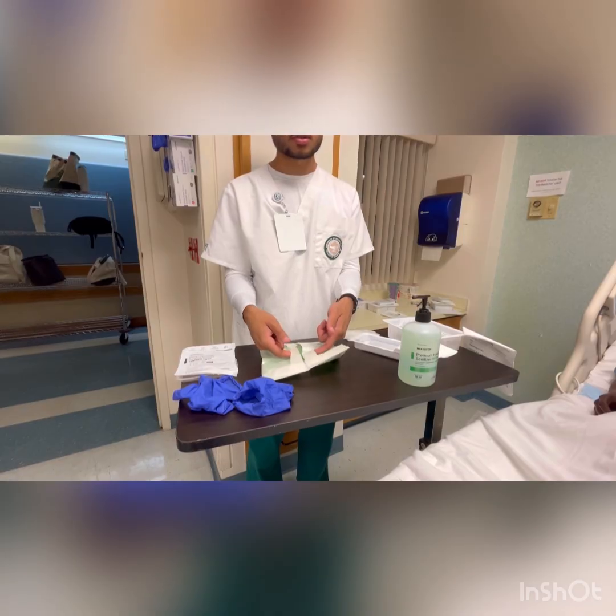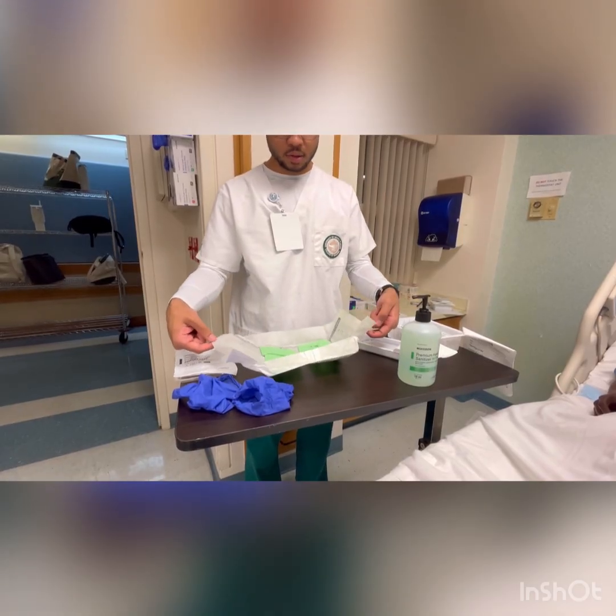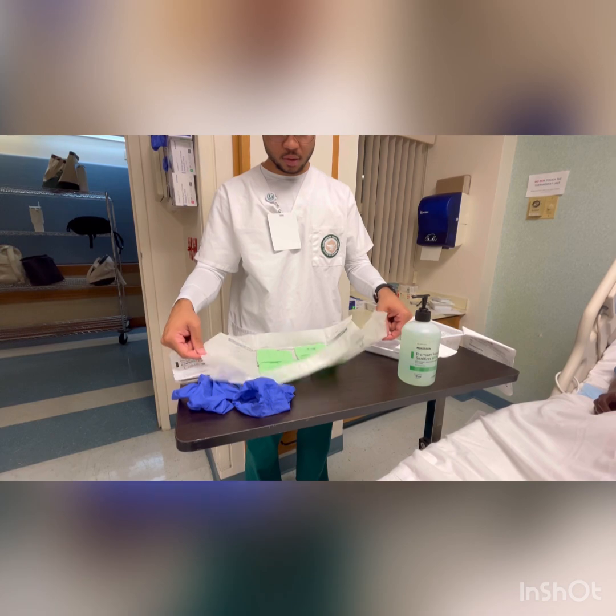Next, we want to prepare our sterile field by placing out our mat. And make sure to apply your sterile gloves and perform proper technique.